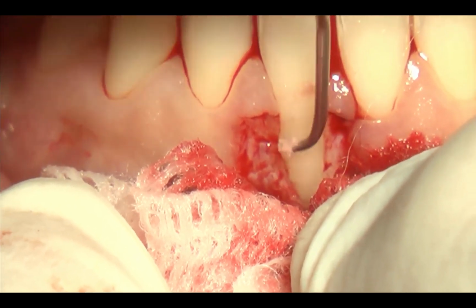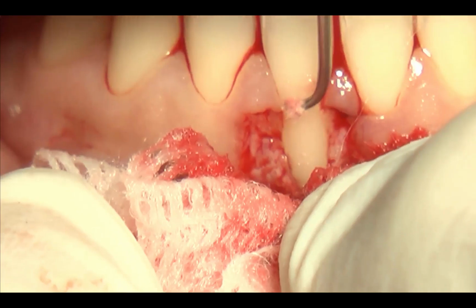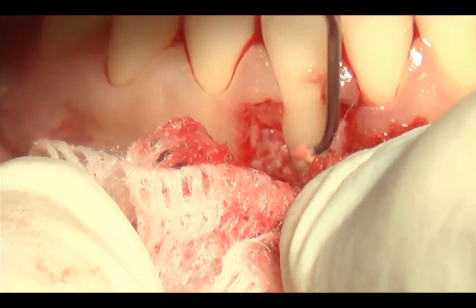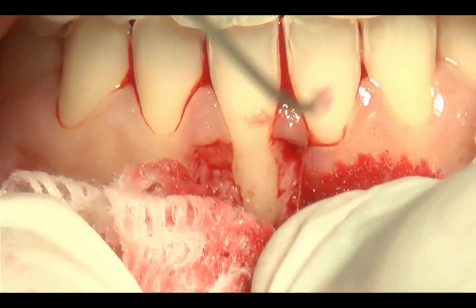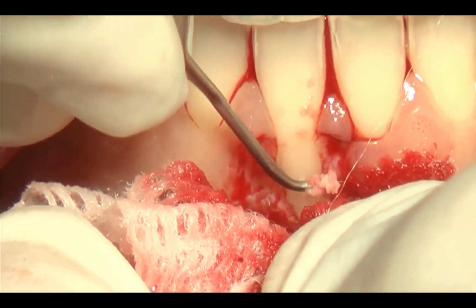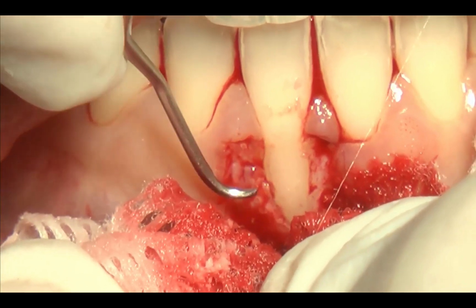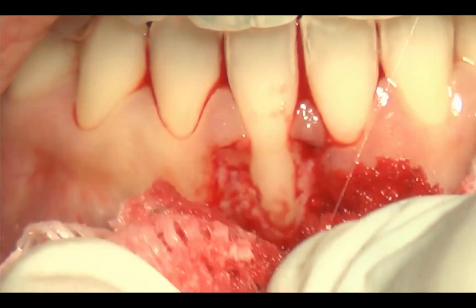It's time to apply the EDTA gel, which is done to remove the smear layer from the dentin tubuli and improve blood clot adhesion.